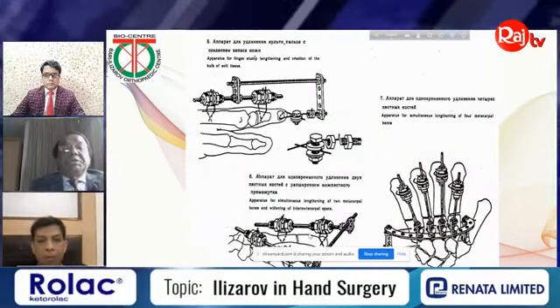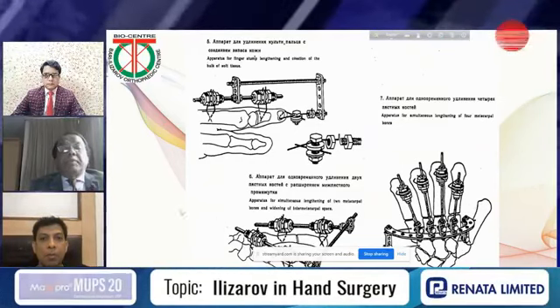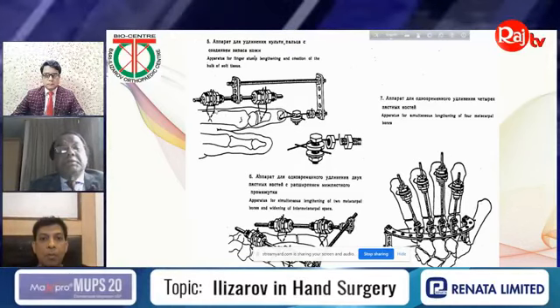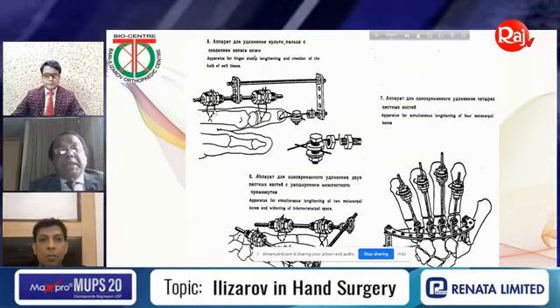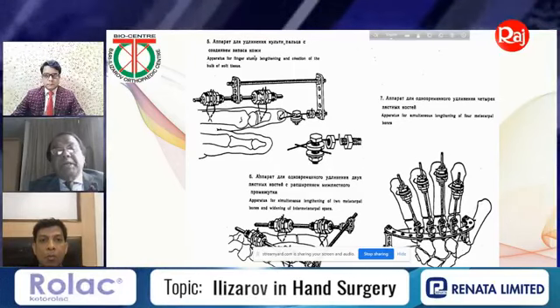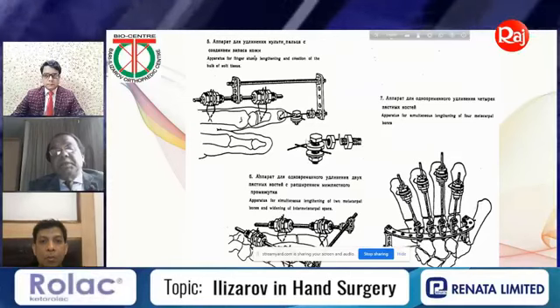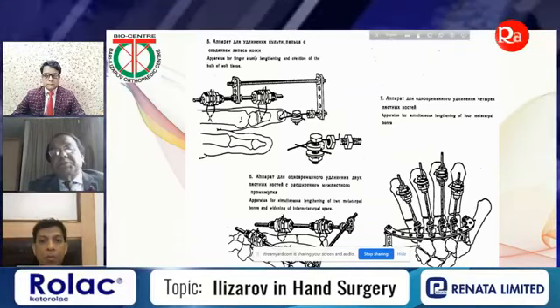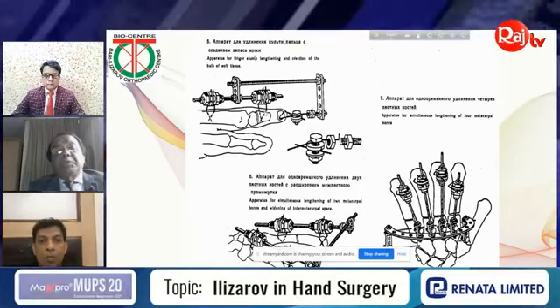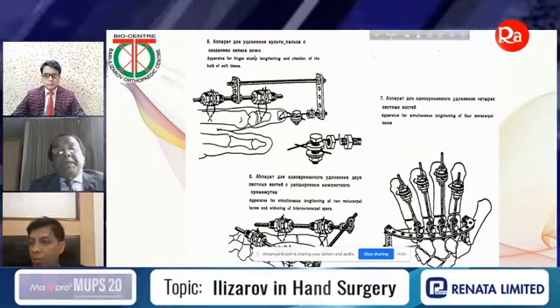Now, you can see here again apparatus for lengthening of the stump. Whenever you are going to lengthen, then how you can put, see here, just 1-2 wires, bend like this, and then again fix it with fixator, bar, put here, and then you can go for lengthening. This is slotted washer, and your wire bending would be like this, and this is fixed to the bar, and here you can put with the plate, small plate.